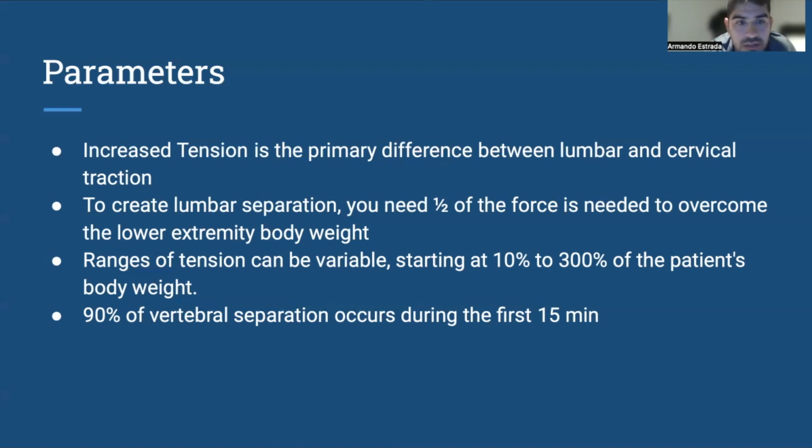The ranges of these tensions can be variable, starting at 10% and going up to as much as 300% of the patient's body weight. Lastly, 90% of the vertebral separation occurs within the first 15 minutes. So it's an important key to note.